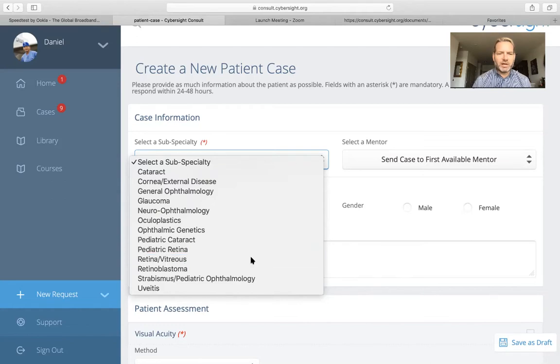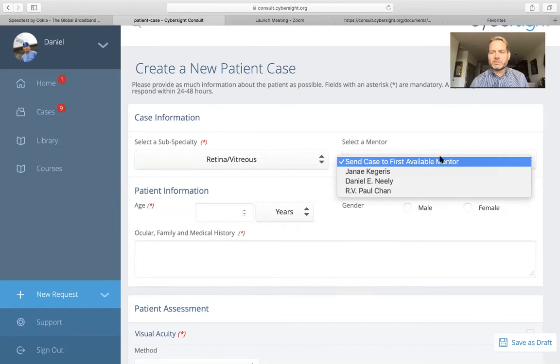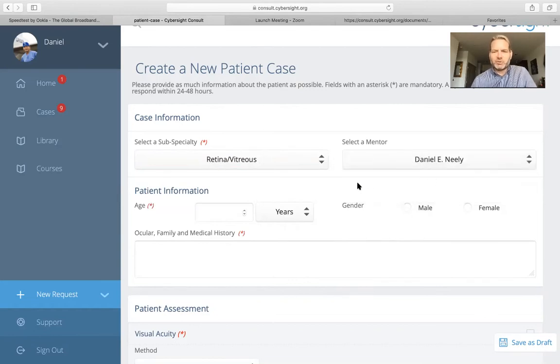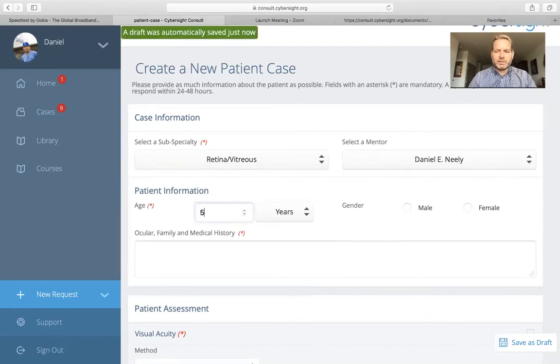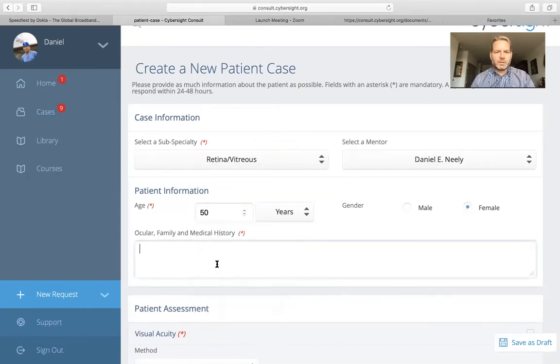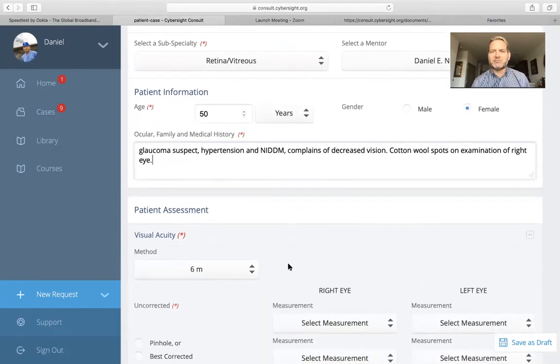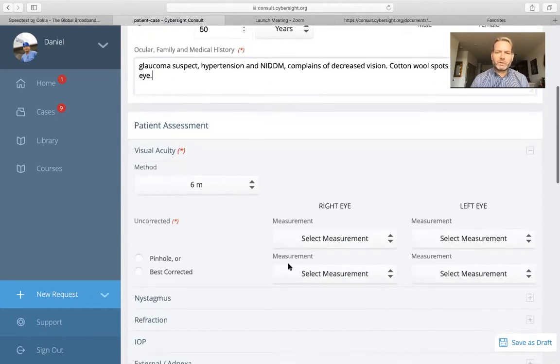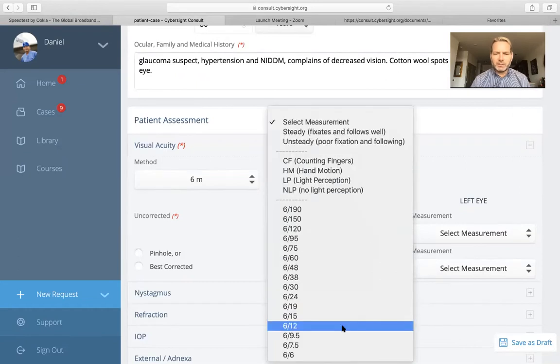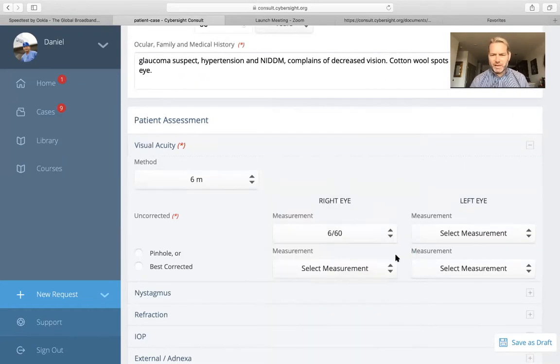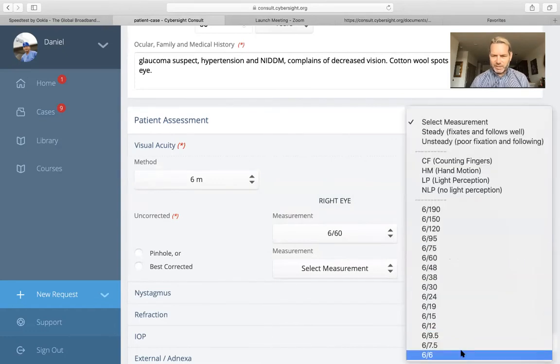For the purposes of this demonstration, I will go to retina for this demo case, selecting myself as the mentor so that it comes to me. We'll put in brief patient information here — a 50-year-old female. Let's say that she's a glaucoma suspect with a history of hypertension, non-insulin-dependent diabetes, complains of decreased vision. For visual acuity, I'll put in some made-up numbers. Let's make her right eye 6/60, and the left eye normal, 6/6.